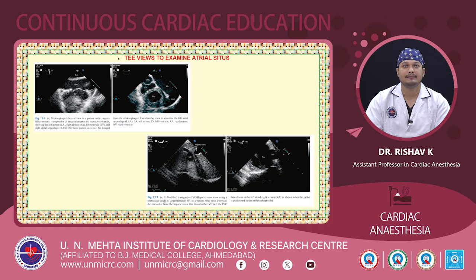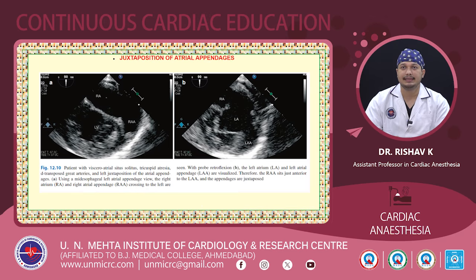Here the patient is having atrioventricular discordance, that is the RA is emptying into the LV, and there is the presence of RAA. We can see that clearly. On the bottom part of the image, that is the midesophageal, the transgastric IVC hepatic veins view, whereby we can see the IVC draining into the RA.